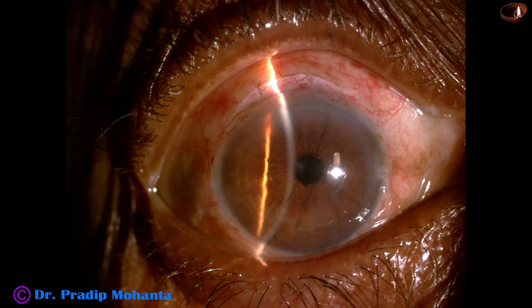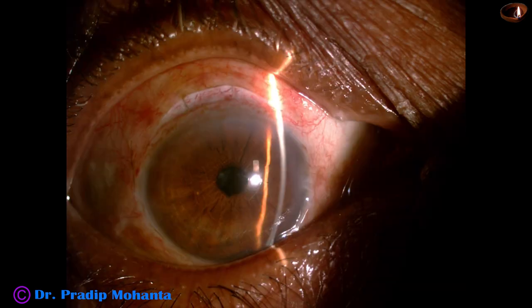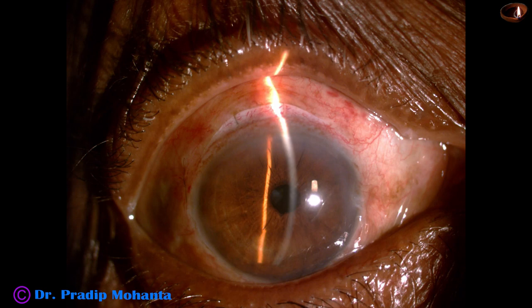Now let us see these post-op pictures. Cornea is clear, anterior chamber is quiet, intraocular pressure is 14 millimeter of mercury, unaided visual acuity is 6/18, and very little astigmatism. The patient is very happy, and this is the safest technique in such hard cataracts.